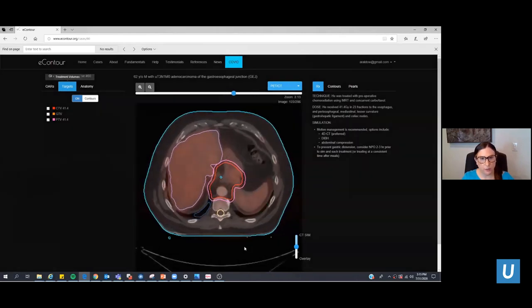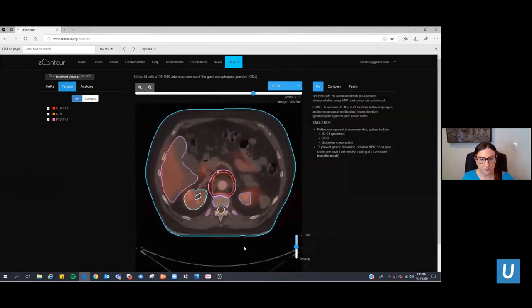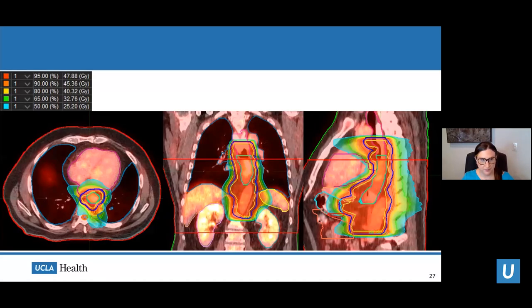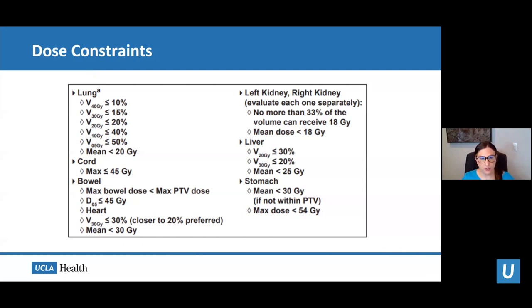Designing these treatment fields is the heart and soul of radiation oncology. The final esophageal plan shows the high dose distribution concentrated at the target, with careful avoidance of normal healthy tissue such as the heart, lungs, and spinal cord. We use very strict dose constraints to protect normal healthy tissues while treating the target. For esophageal cancer patients, the organs at risk include the lung, spinal cord, bowel, kidneys, liver, and stomach.